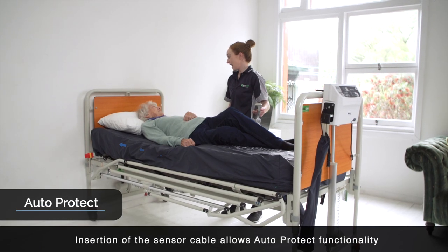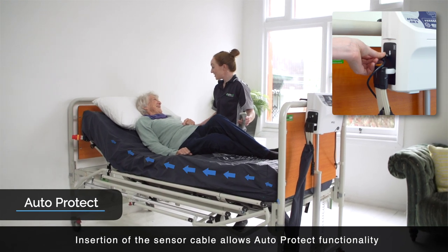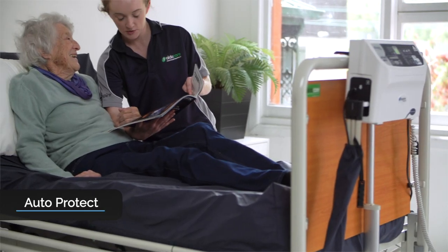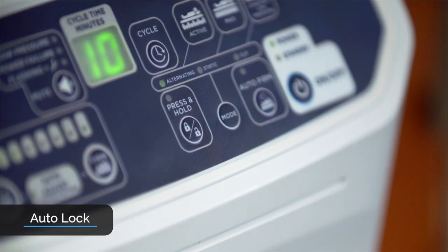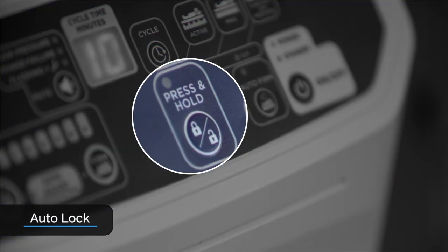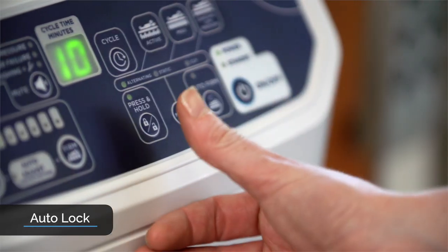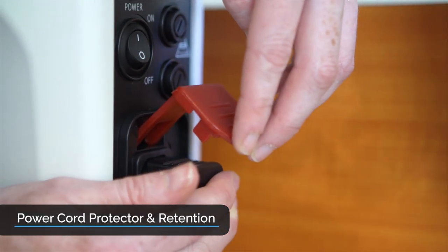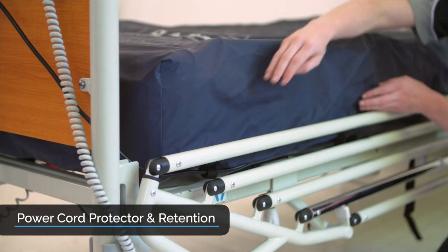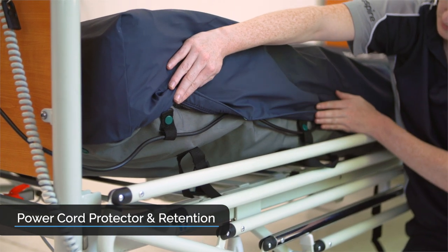The Active Air 8 has a safety feature known as Auto-Protect: when the head of the bed is elevated past 45 degrees, pressure automatically increases from the pump, helping to prevent bottoming out in a more upright position. Auto-Lock means that after 30 seconds of inactivity, the control panel automatically locks and cannot be tampered with or accidentally changed. To unlock the control panel, simply press and hold the lockout button until the LED light turns off. The Active Air 8 also has a patented protector feature to prevent accidental dislodgement, and the cord can be retained on either side of the mattress for maximum safety, reduced tripping risk, and convenience.